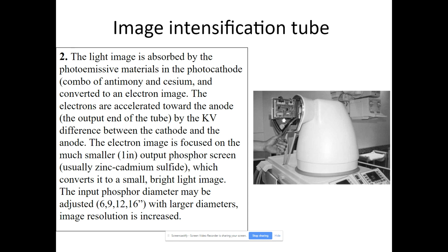So we're going to apply just 25 kV. Doesn't sound like a lot, but when you write it out, 25,000, and you tell someone that's 25,000 volts when they're used to like 110 and you plug in your lamp, it's a lot. We use a lot of voltage in our daily activities, and we don't even really think too much about it. I use 50 kV on a hand. That's not even that much, right?